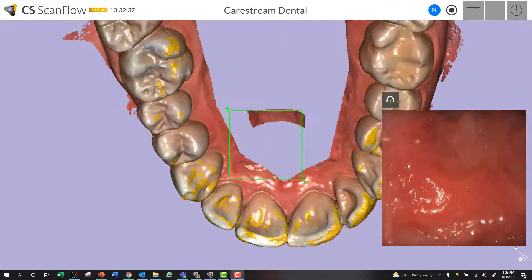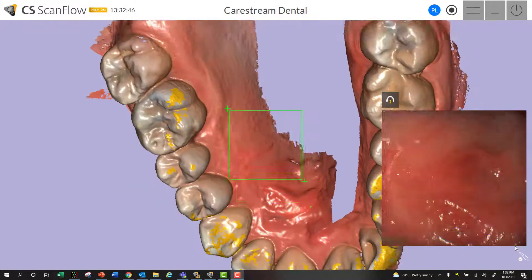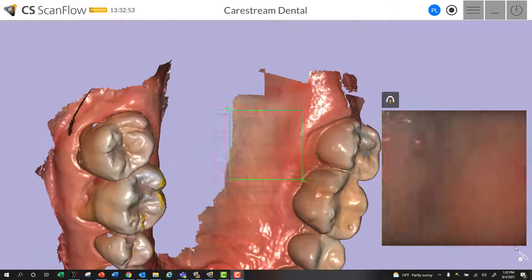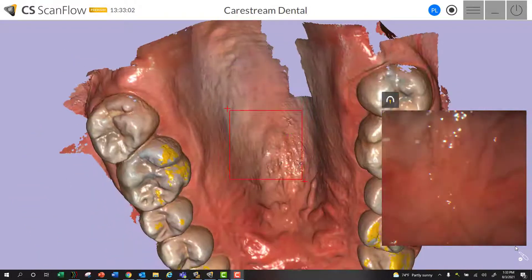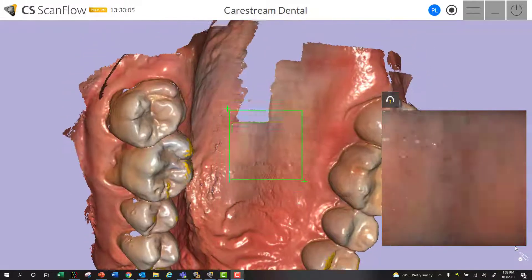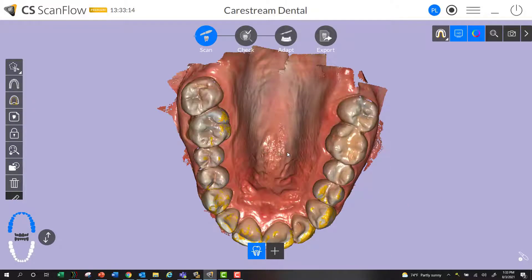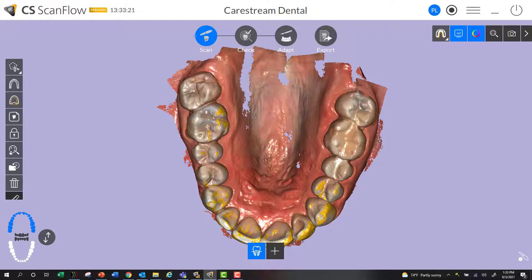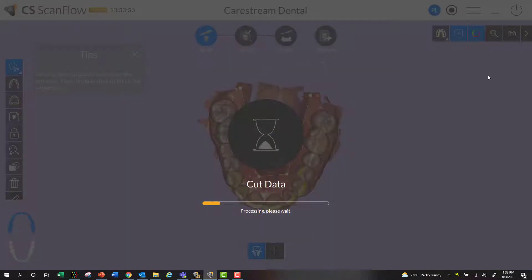Here's another example. In this example, I'm currently scanning with the 3600 on the strong soft tissue removal setting. The example is when you're scanning the palate or longer and smooth edentulous spans. If you're using the strong soft tissue removal on smooth edentulous spans, this type of thing can happen where you can see all of a sudden you have holes in the smooth tissue where you scanned it, but then it just kind of disappears.